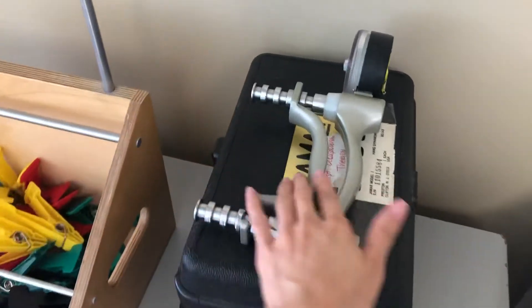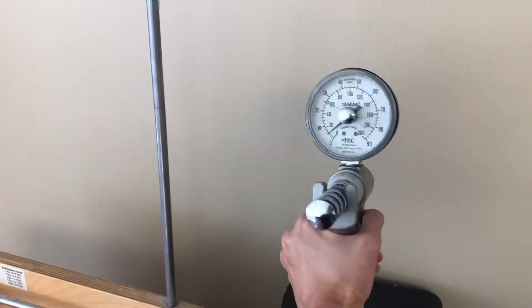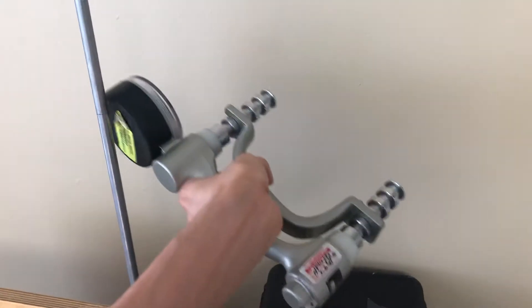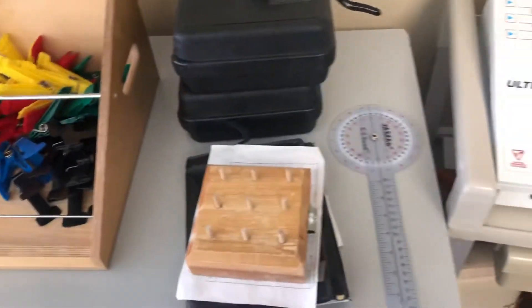And here is the dynamometer, which you squeeze to measure grip strength. You have to release it first, but I can't do that one-handed.